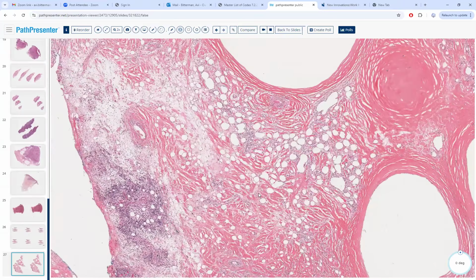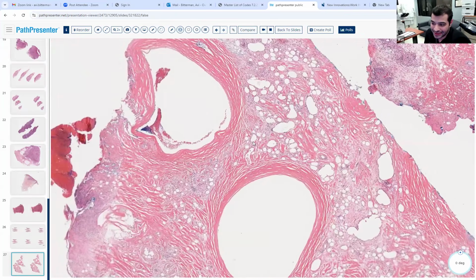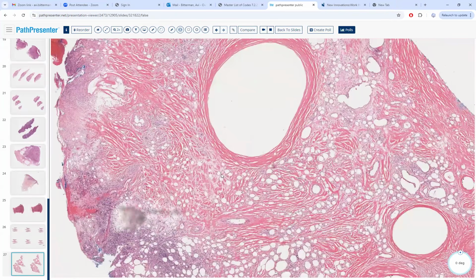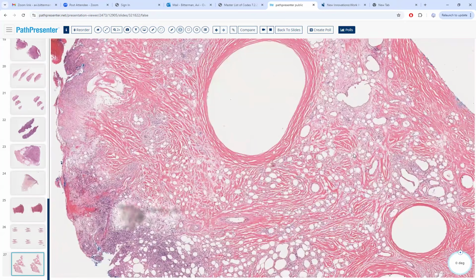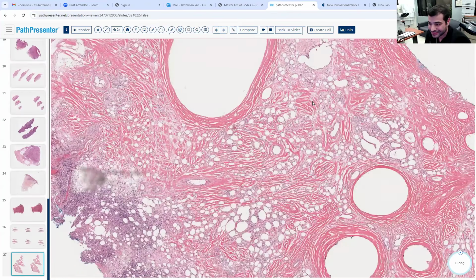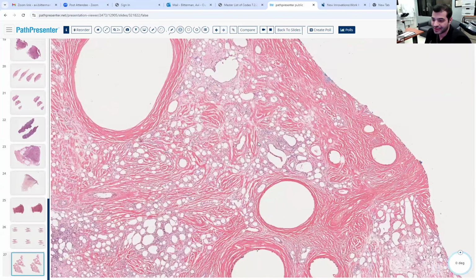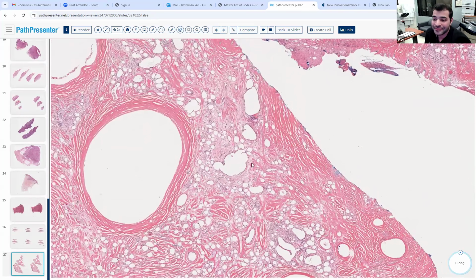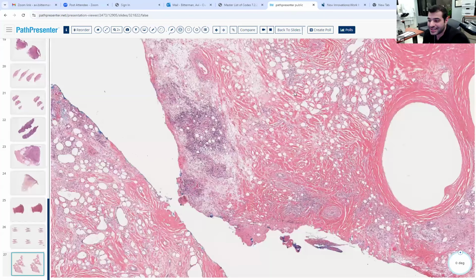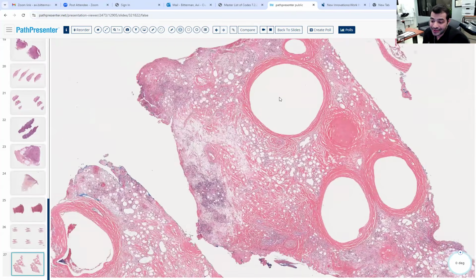Those are two common locations where you can see paraffinomas, or these reactions to all sorts of weird filler materials that you can get in some back alley. In some cases they can ulcerate or get necrosed.